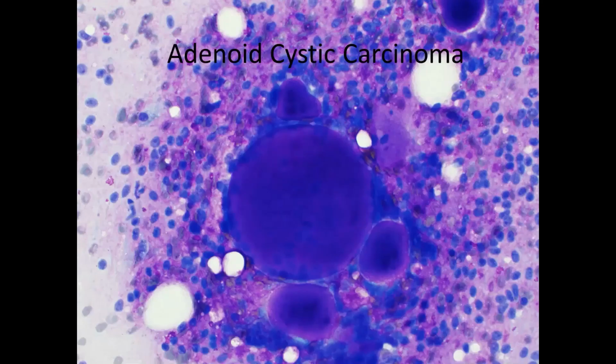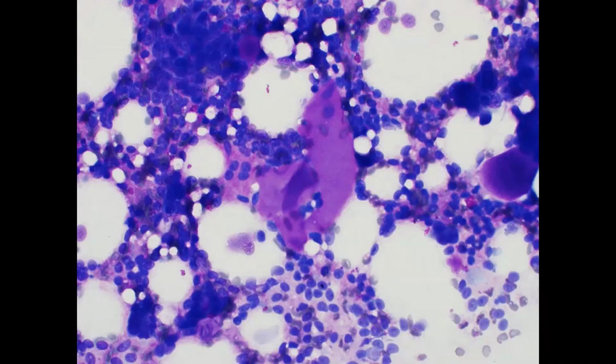Again, you can appreciate that the larger the balls of stromal material and the more abundant they are, the more consistent with an adenoid cystic carcinoma that is, to me, in my mind. And again, even though these are malignant tumors, the basaloid constituent cells are very bland and monotonous with high NC ratios. So it's not the individual cells that tell you this is malignant, it's really the overall pattern and taking everything into account.